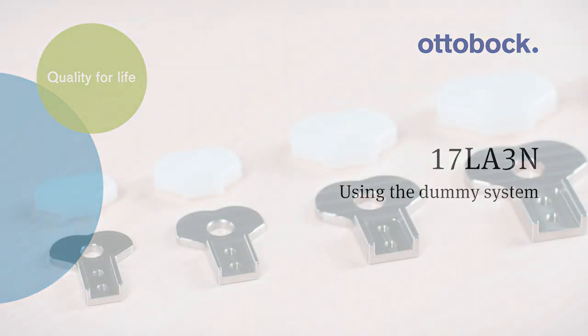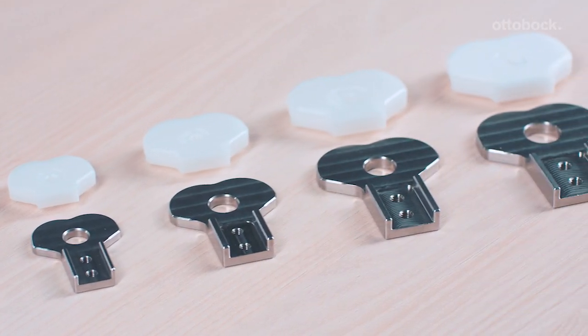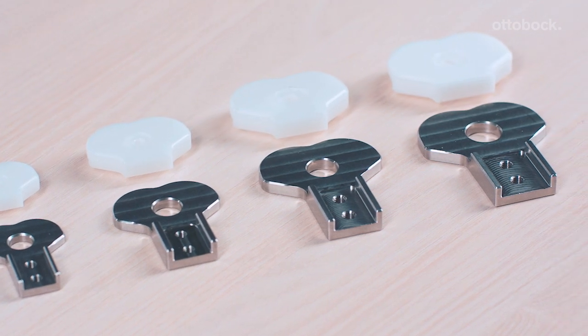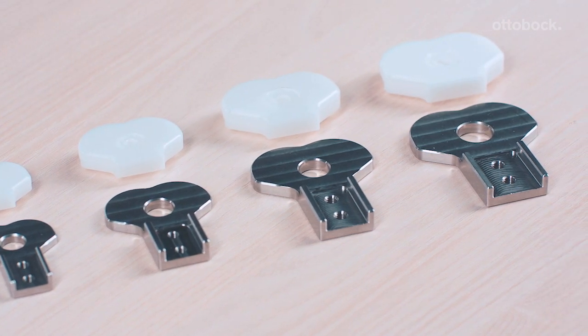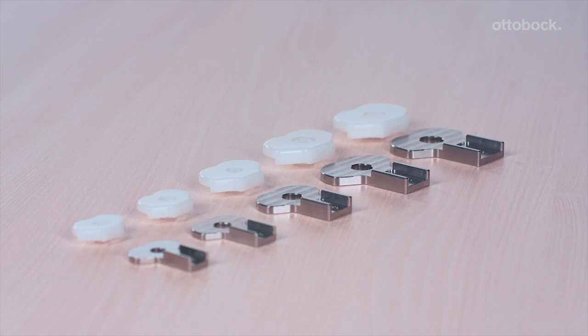The 17LA3N unilateral ankle joint has a new, efficient dummy system. This new dummy system makes it easier to fabricate an AFO or KAFO using lamination resin or pre-preg technology, and allows for even cleaner processing of the unilateral ankle joints.